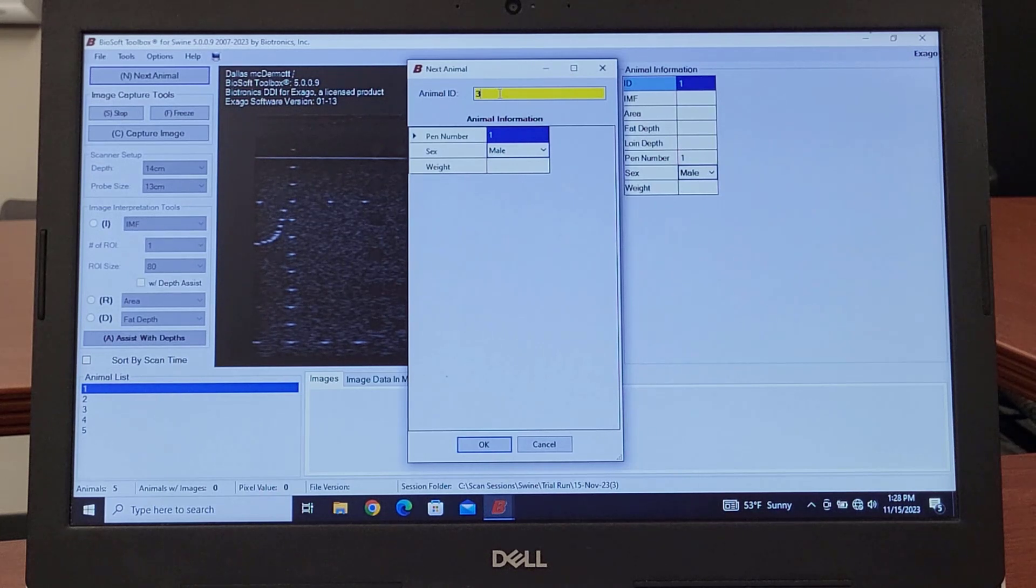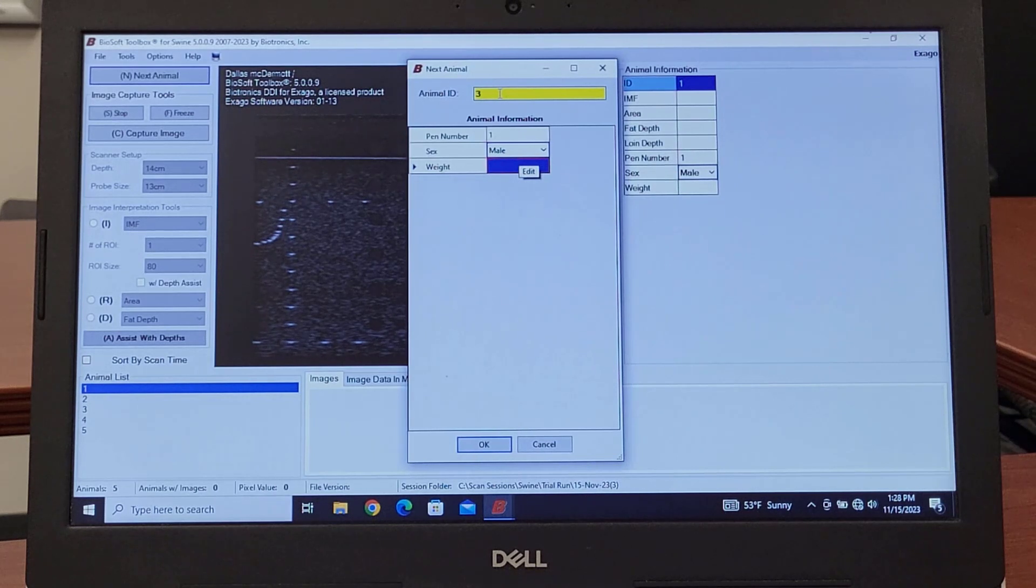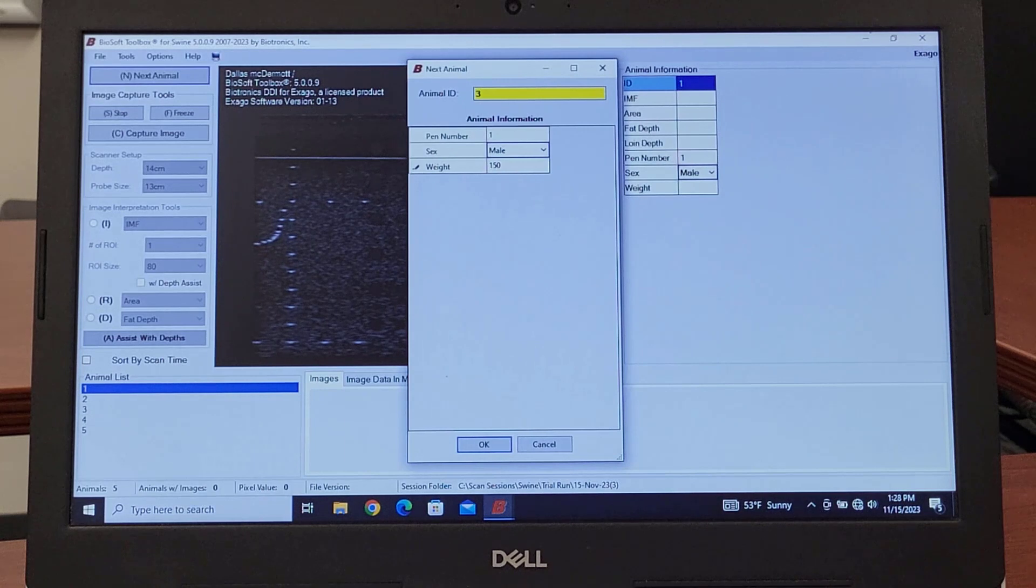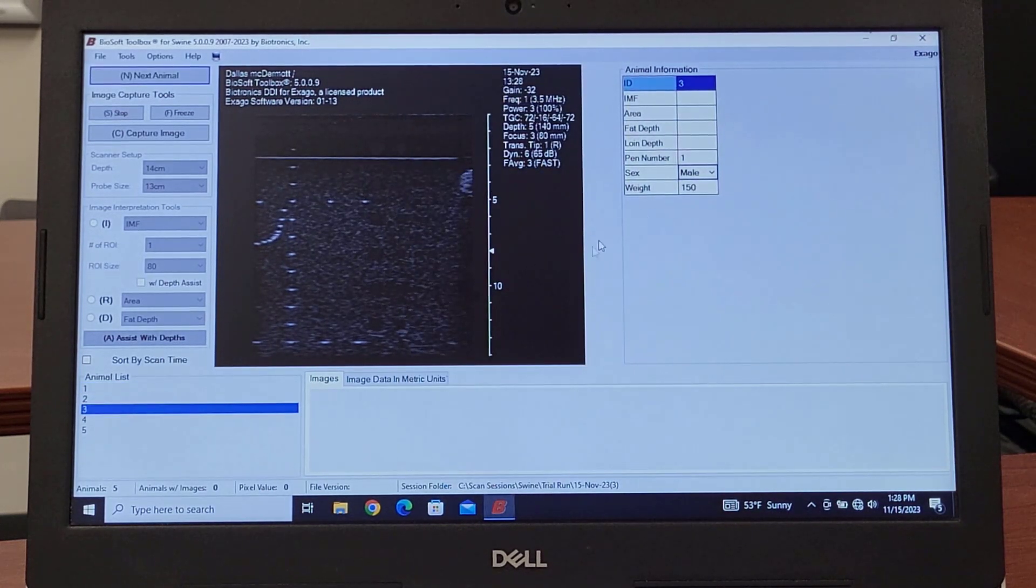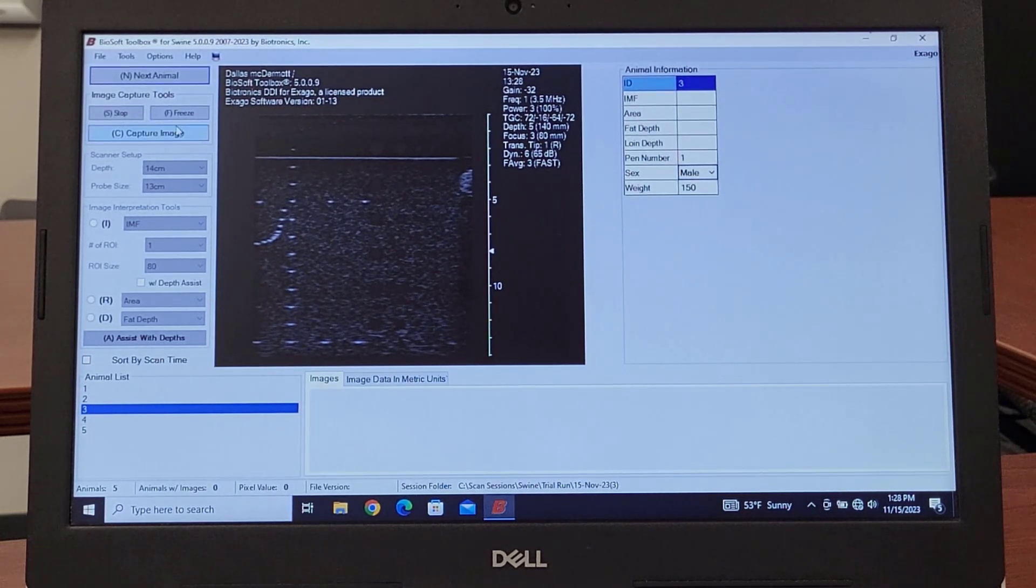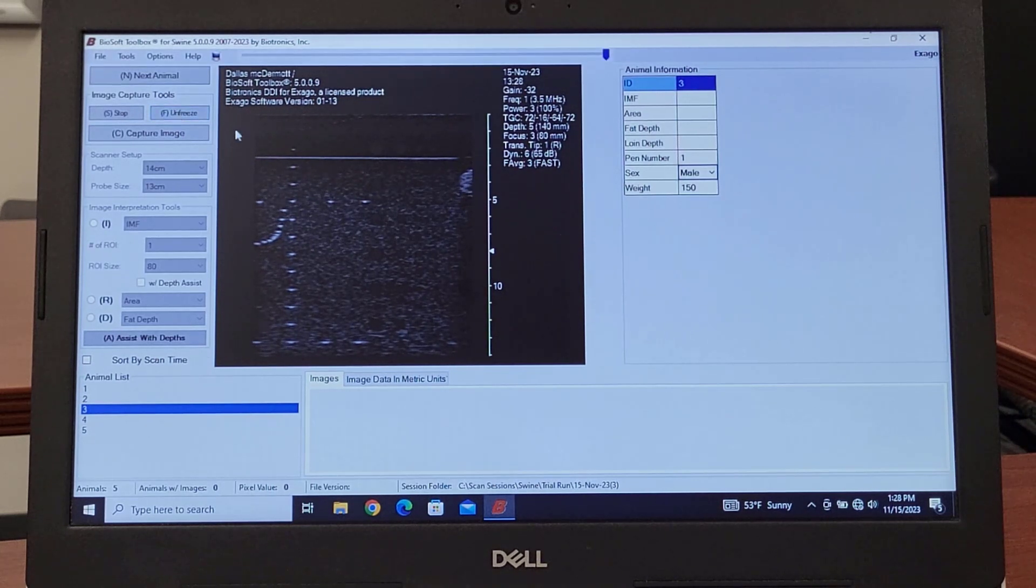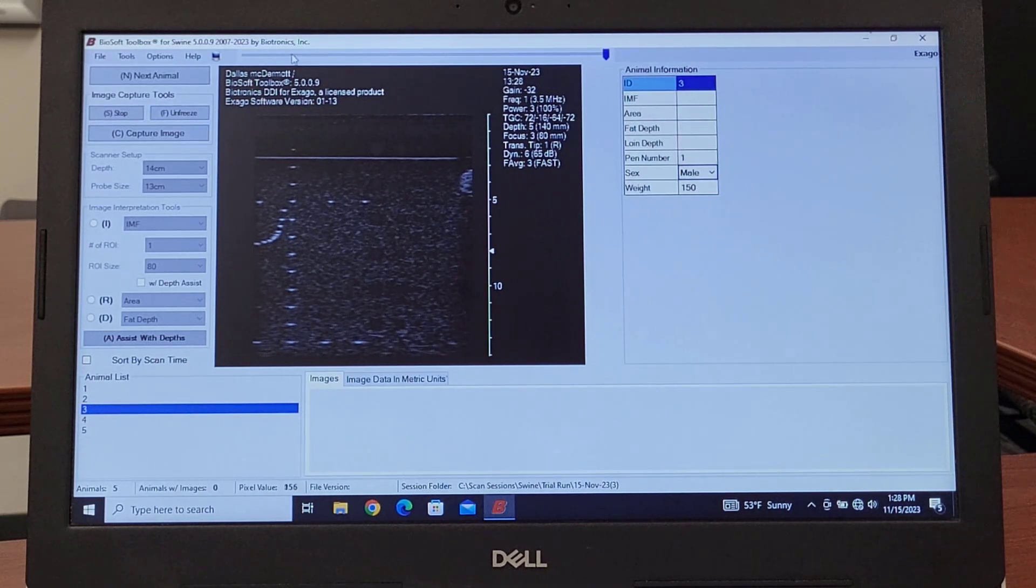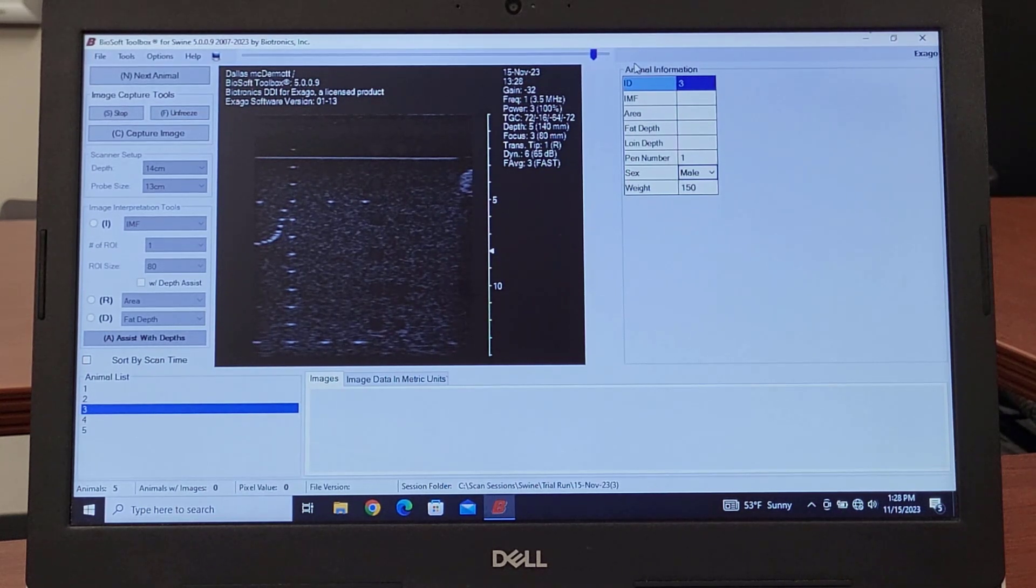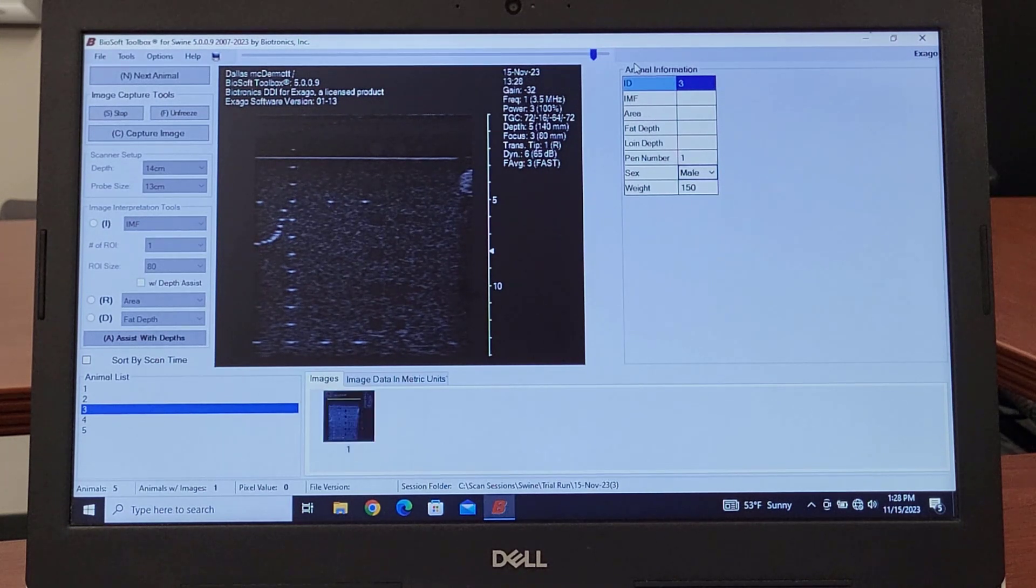So we'll just go down and weigh the animal. Let's just say it weighs 150. Either click on OK or do whatever. Now all of a sudden we've got a weight in there. Now we're ready to scan the animal. Scan it, go ahead and freeze that image. If we're just collecting one image you can capture that image, or if the animal moved a little bit, you just need to back up a little bit. If you're just doing say a loin eye area, back fat, we can capture that image.